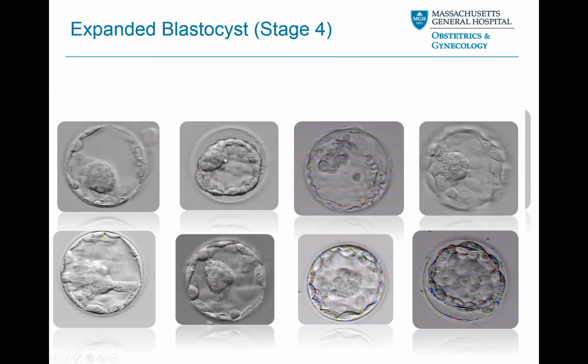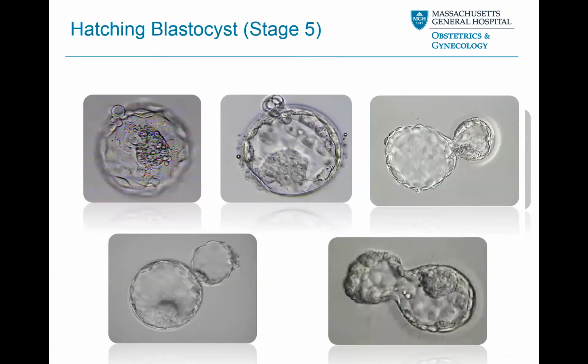Here's an embryo that looks a little funky, right? Because it's kind of squishing down. But this is actually a really beautiful embryo. This is something that embryos do naturally. They expand and contract, and expand and contract, and that's part of the process of them trying to thin out the zona pellucida and really escape and hatch from the zona. If you're learning to grade with me, you can see that this inner cell mass is really dissociated, kind of broken apart. Not the best, but these are the decisions that we make in the laboratory every day.